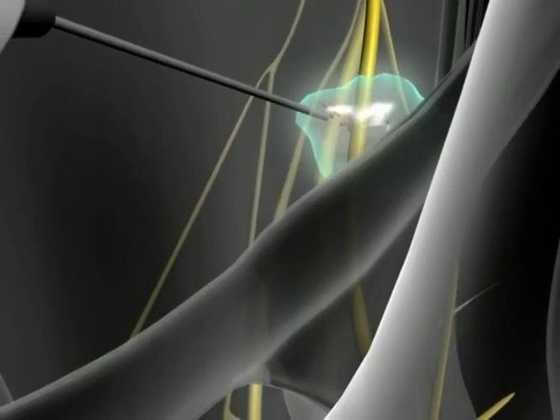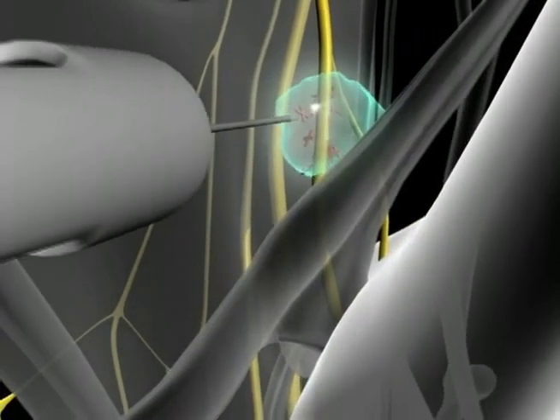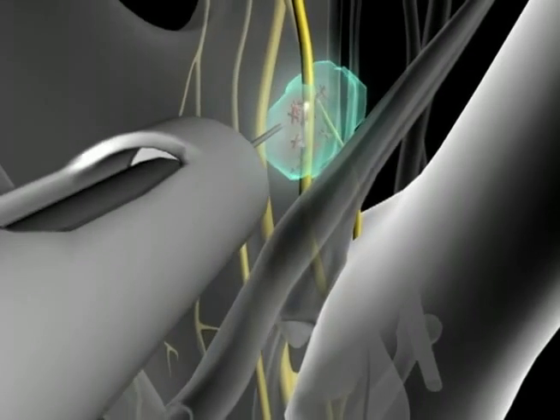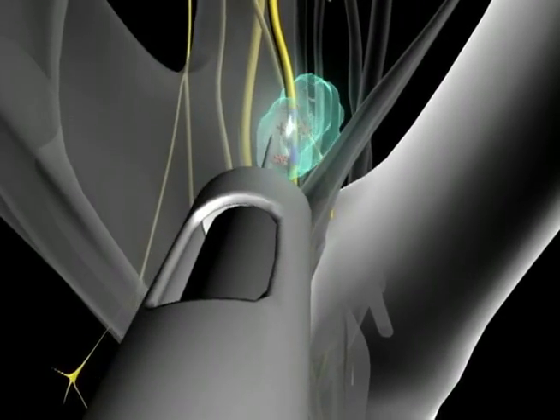We'll pull back a millimeter or two, aspirate, and then deliver the anesthetic. Begin the flow of anesthetic at a slow rate so that you have completed delivering the entire cartridge in about 1 to 2 minutes. Then carefully withdraw the needle, following the same path used for entry.